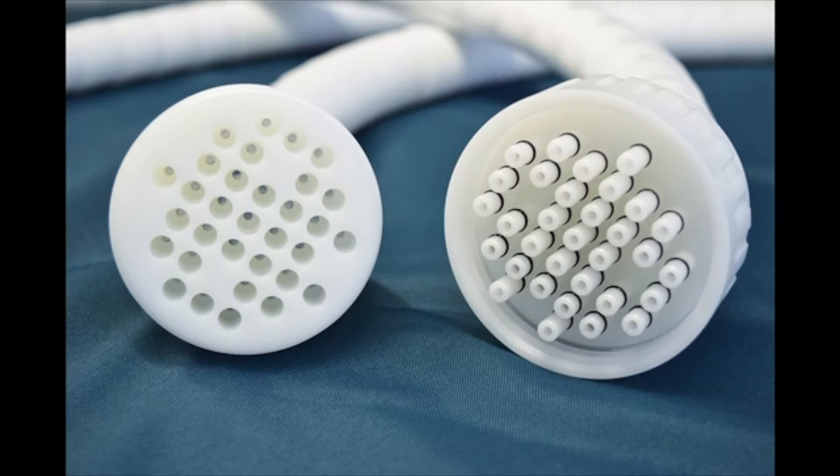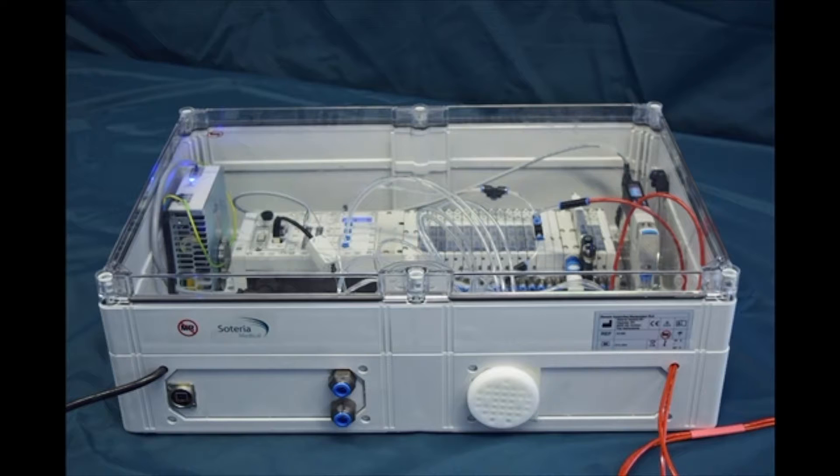These are the connections for the compressed air tubing which moves the robot, and this is kept outside the MRI room. They are connected to this control box of the compressor.